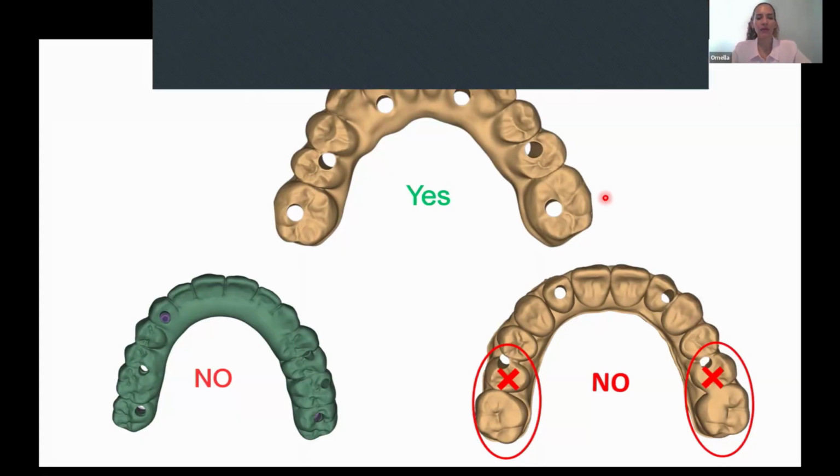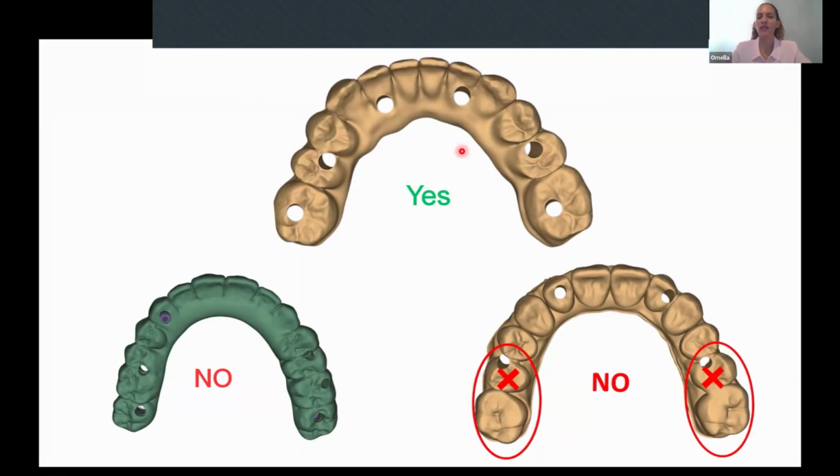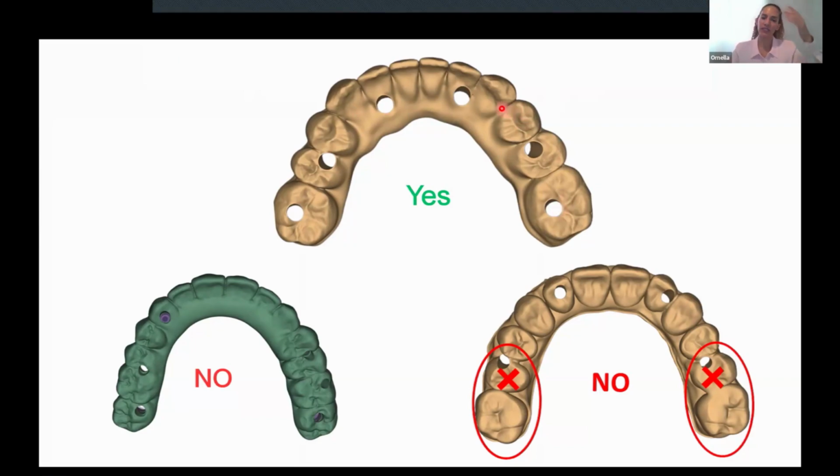The first image that we can see in the top, we have 6 implants, as you can see. The distribution between them is really good because we don't have more than 2 pontics, as I mentioned, remember? No more than 2 pontics between implants or pillars, okay? And finally, when we think about an all-on-6, 1 implant is supporting the forces of 2 elements, okay?